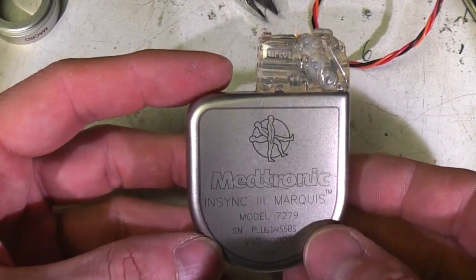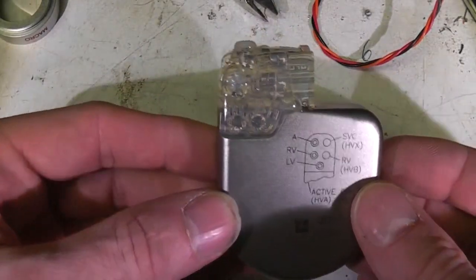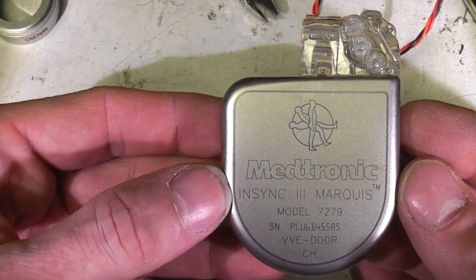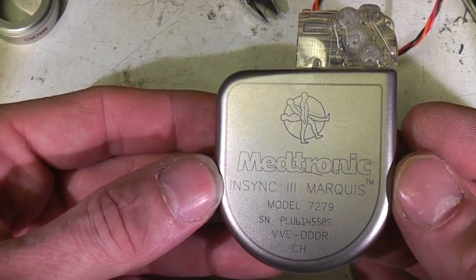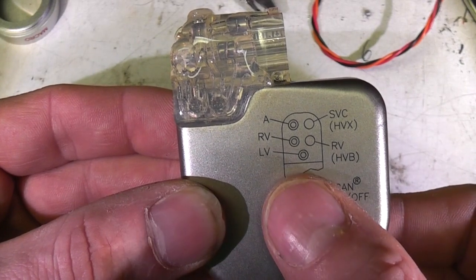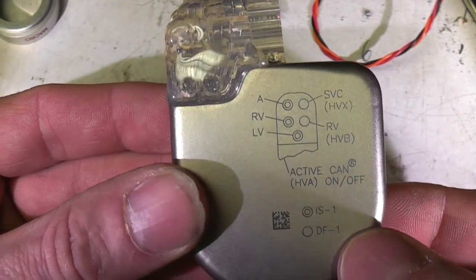This is an implantable cardiac defibrillator for people with heart conditions. They implant this thing. If it detects an abnormal rhythm, it zaps it with a voltage to get it going again. It's made by a company called Medtronic, InSync 3 Marquis, and helpfully it actually shows the connections on the back. I'm guessing RV, maybe right ventricle, LV left ventricle, A aorta perhaps. Not sure about the other two.